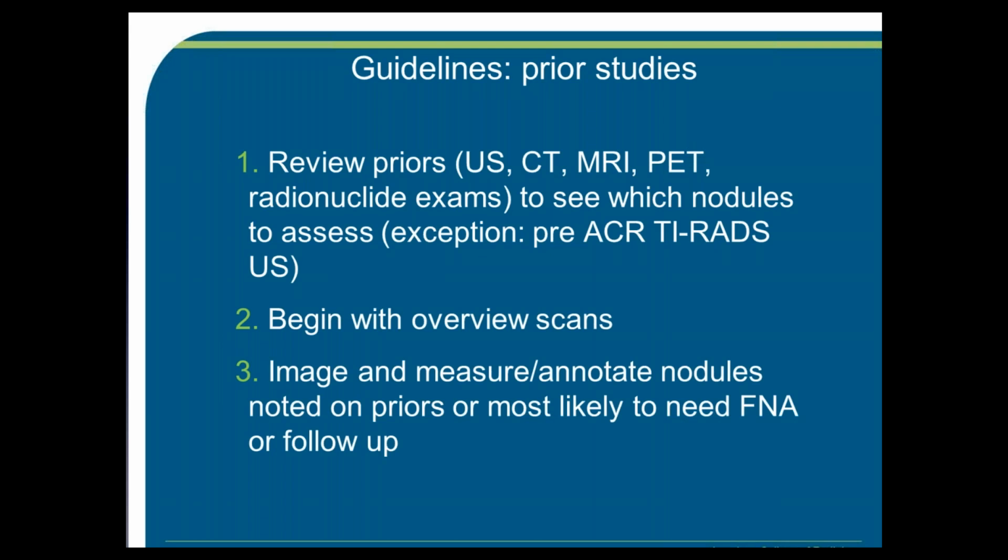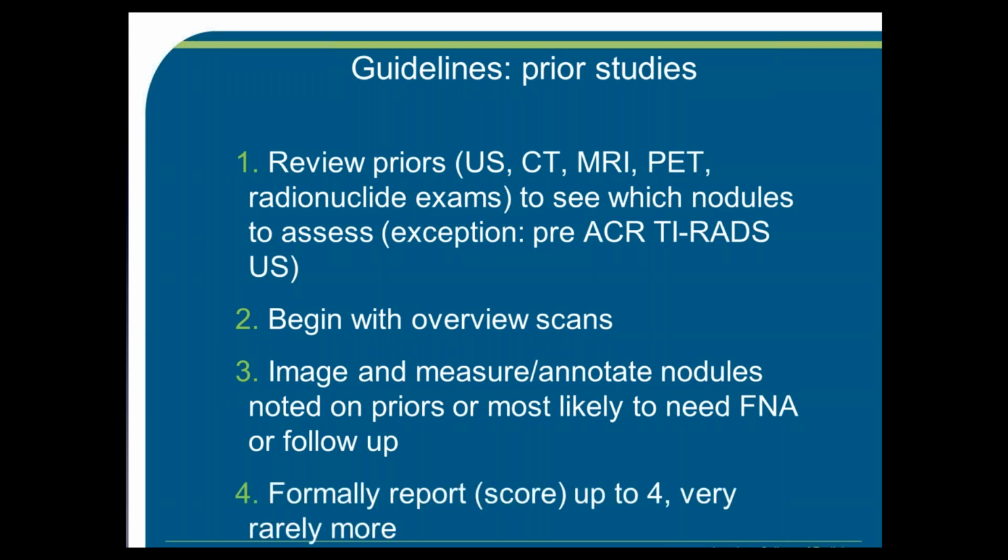So, for example, if you have a PET scan that shows something that's FDG positive, you definitely need to report that on your ultrasound if there's a corresponding nodule. If there's a CT that shows a nodule, you need to report that on your current ultrasound scan, even though it may not warrant FNA or follow-up. And that's to answer the clinical question for which the ultrasound was ordered. And again, I very, very rarely, or in my case so far, never report more than 4 nodules in a gland.